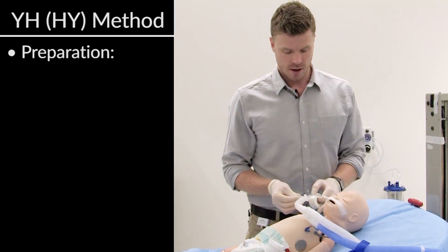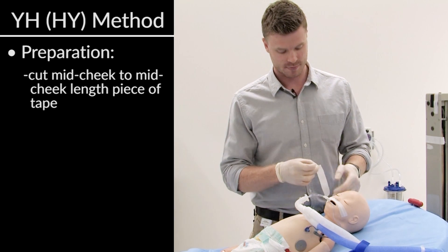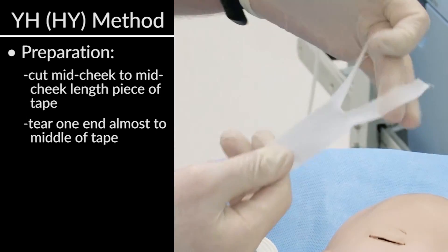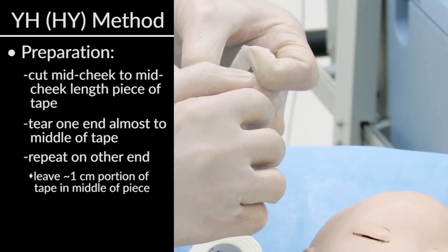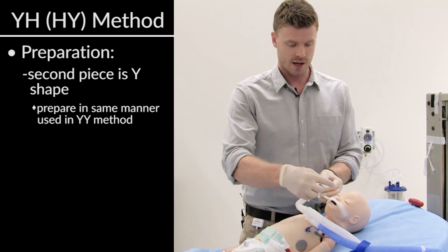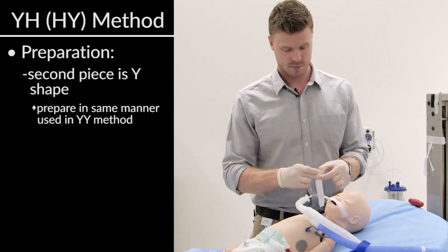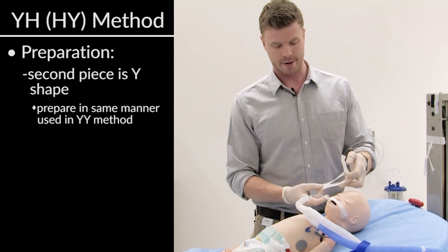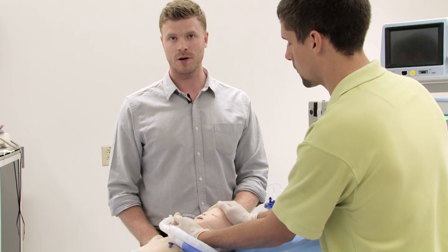I'm going to review our second method for re-taping oral endotracheal tubes. We refer to it as the YH method. Measuring a length from approximately mid-cheek to mid-cheek, I'm going to prepare the H by cutting a strip down to almost the middle — that's basically a Y — then going from the other side and doing the exact same thing, leaving about a centimeter portion of tape in the middle. You can see our H. The second piece of tape we're going to need is a Y, exactly the same as the first method. So we've prepared our tape, prepared the face, washed it down with saline and gauze, laid down our protective barrier, and now we're going to apply the tape.